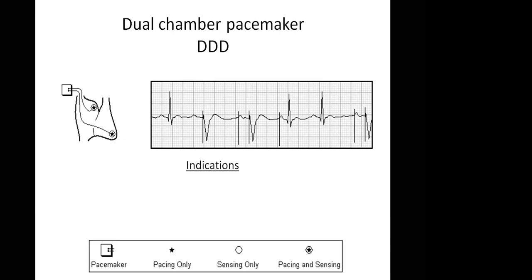I have a question. You can see that the first QRS complex seems to be a twisted one. Then there was a P wave, then a pacing of the ventricle. After the pacing of the ventricle, there was just a long pause, then the atrium had to be paced again, then the ventricle is also paced again. My question is this: pacing the atrium here, won't it by itself produce an AV contraction? Why is this atrial pacing, the second spike, not being conducted down? Why do we have to pace the ventricle here again, even before we are sure that conduction is prolonged or that the ventricle is not coming by itself?